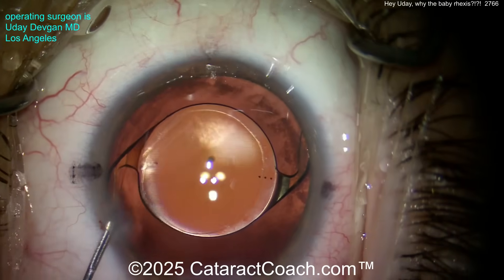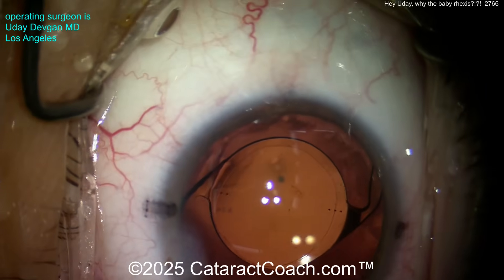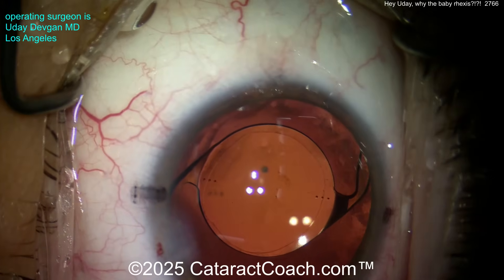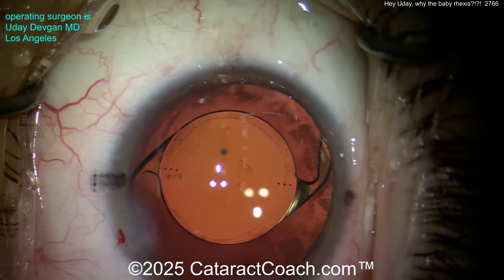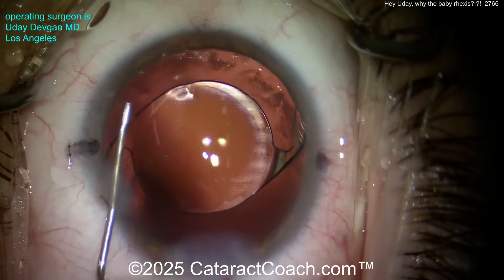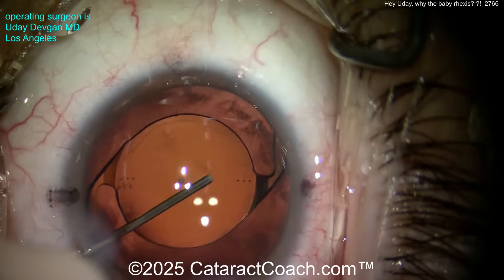Look at that rhexis — it's overlapping beautifully. There will be some capsule contraction in the post-op period, so the rhexis will become a little bit smaller, but that's a full 360-degree overlap for sure. Yeah, it's pushing the envelope a little bit, but we're playing the big leagues here. If this was my eye, I would be thrilled. Here's an angle sweep to get that last viscoelastic out.